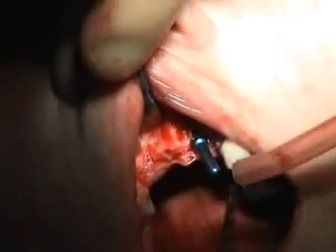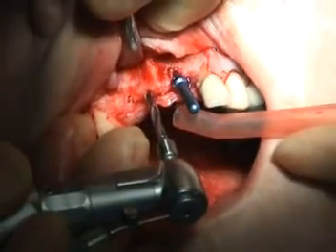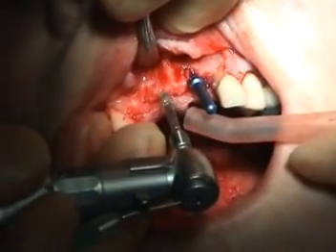Here, a guide pin is being used to verify the angulation and position of the initial implant site.